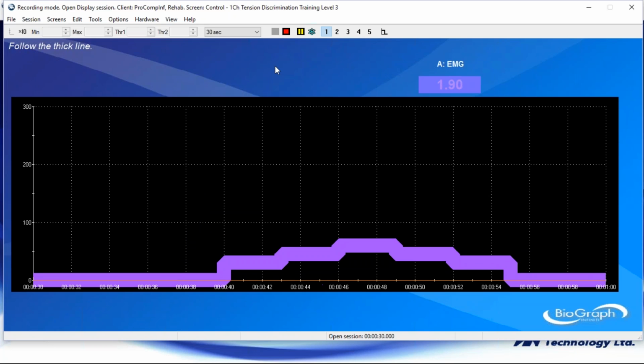And then as we go to the next screen, it's maybe a little more challenging. The shapes may be different. Again, we have some templates that are standard. When we start talking about the MyoTrack Infinity, there's going to be more for the pelvic floor, a bigger range of templates. And again, you can always create your own. We can work with you on doing that.